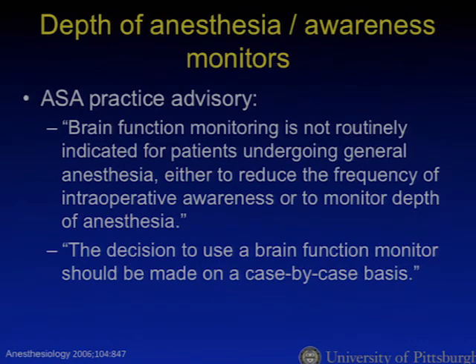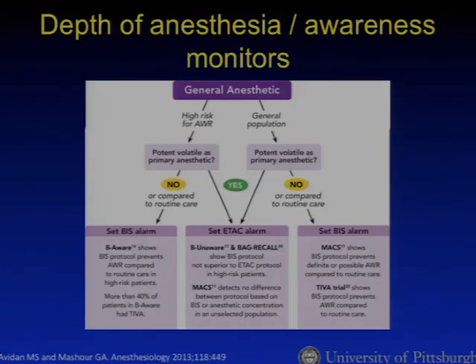These monitors attracted a lot of interest initially and gained market share based on, I think, one flawed study. And since then, level 1 evidence has emerged that BIS monitoring is not superior to end-tidal anesthetic gas concentration monitoring, and therefore is not really routinely indicated. However, there is evidence that there's a role for processed EEG, or BIS specifically, which has been studied in at least one trial.